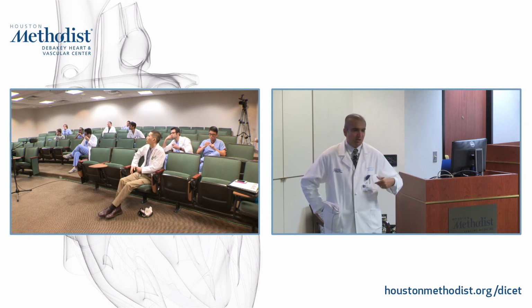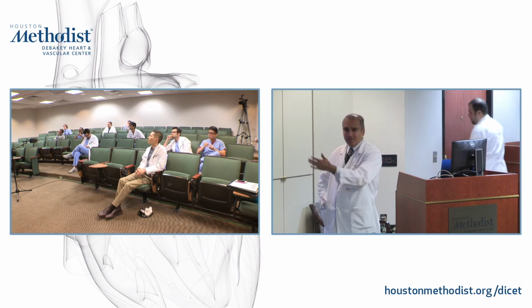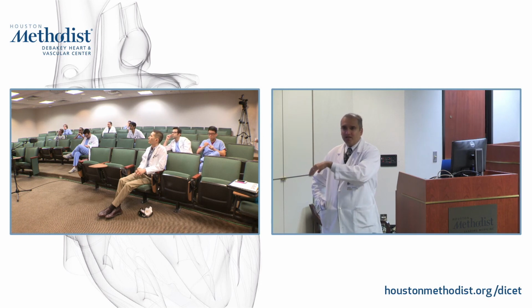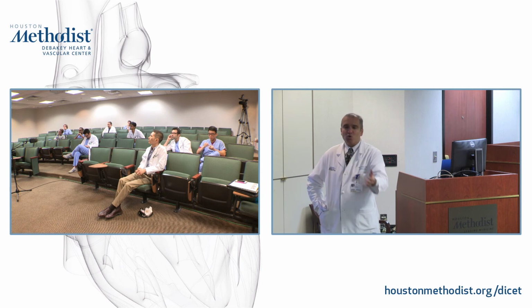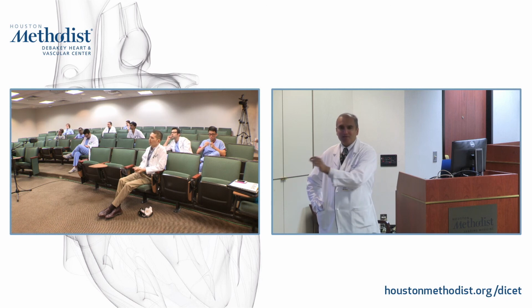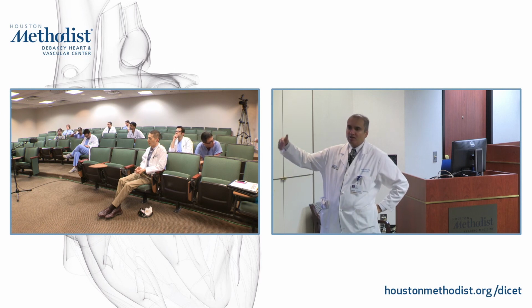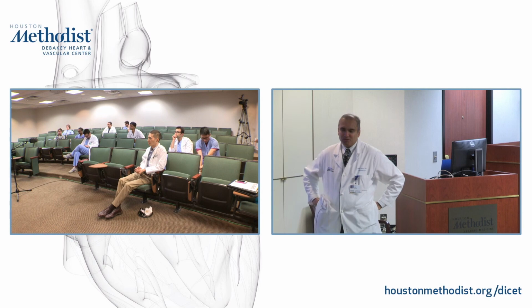So for example, and I'll touch on this, I think, in a couple of weeks when we talk about cine imaging, we'll talk about the fact that you could do cine imaging with a quarter of the lines of data, a half of the lines of data, or all 100% of the lines of data. And you'll see that the pixel size is larger if you do fewer lines of data. So each line of data that you acquire allows you to get higher and higher spatial resolution. So this will make more sense in a couple of weeks.